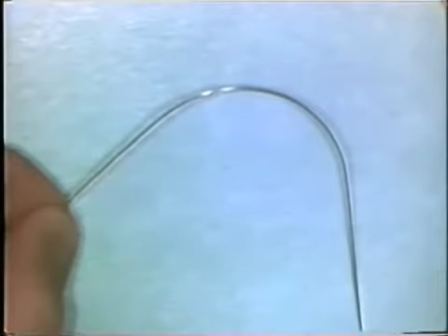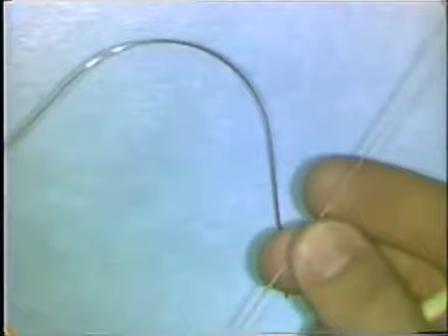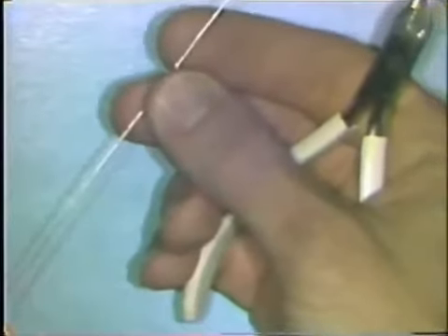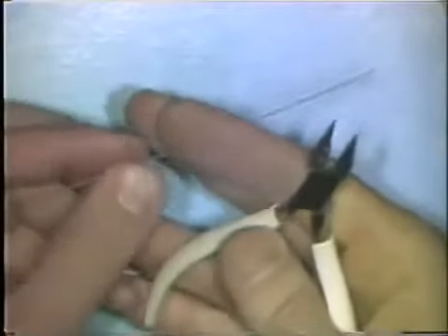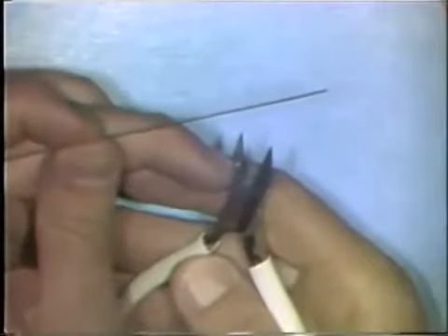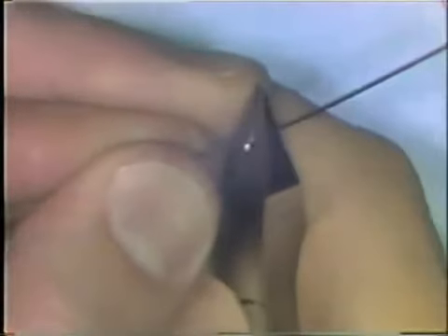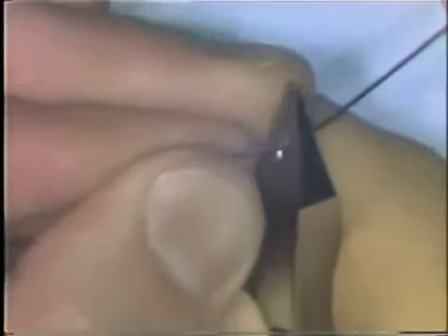Curves are formed from a series of small bends that are very, very close together along a wire. To make a curve, you use the 139 bird beak pliers and place the wire deep into the plier beaks near the larger portion of the round beak of the plier. Using your thumb, make a series of very tiny bends very close together — in the wire, this forms a curve.